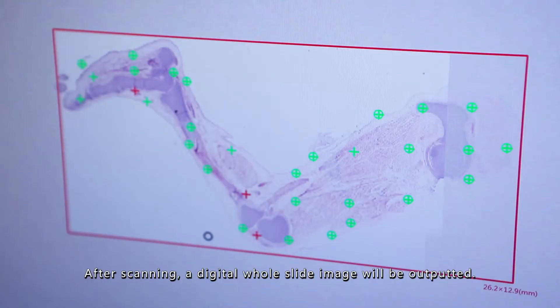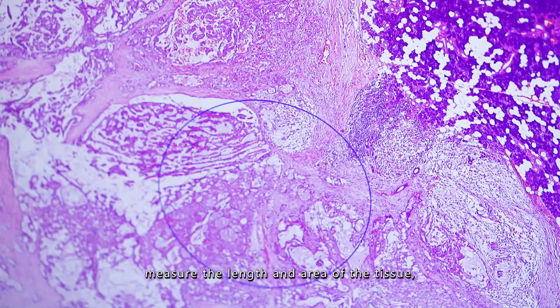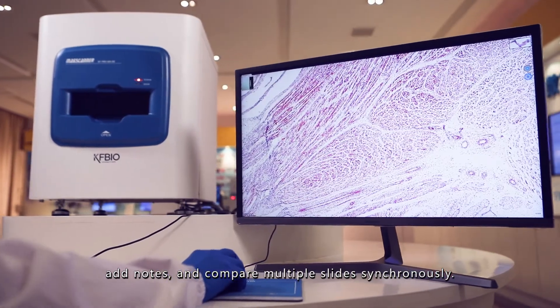After scanning, a digital whole slide image will be outputted. The pathologists are able to browse quickly, measure the length and area of the tissue and nodes, and compare multiple slides synchronously.